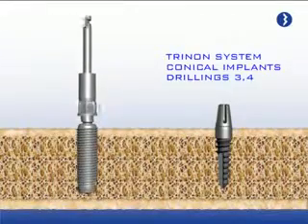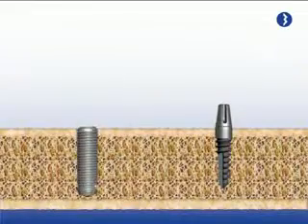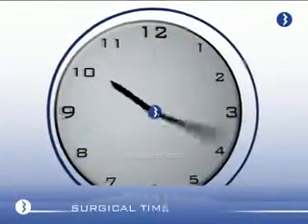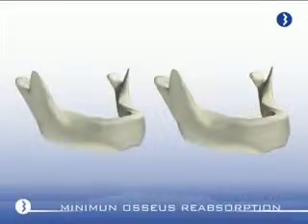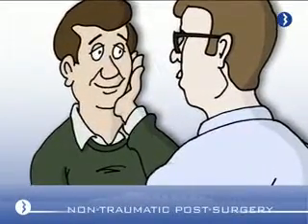The great simplicity of the Q implant drilling system gives us 3 great advantages. Reduction in surgical time. Minimum osseous reabsorption. Post-operation is untraumatic for the patient.